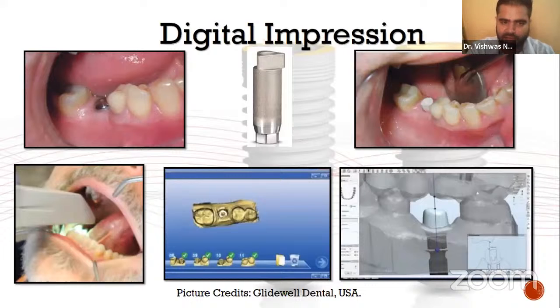Now, finally, we have the digital impression technique. Since we are living in the digital era, where we are using 3D printed custom guides to place implants and the whole workflow is going digital, impression making in implant dentistry has also gone digital. This can be done with the help of a specialized impression coping called scan bodies. These scan bodies can be secured onto the implant fixture head with a screwdriver, and after that the impression can be made with the help of a digital intraoral scanner.